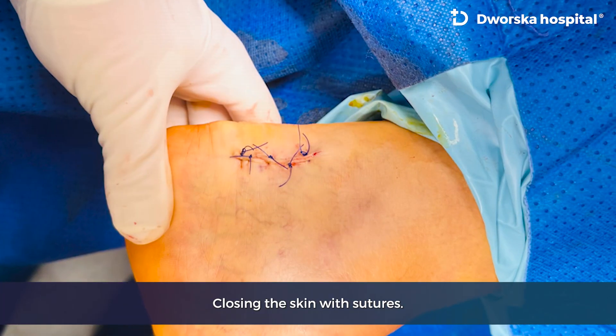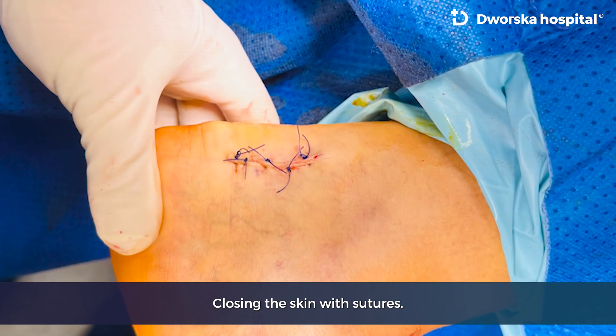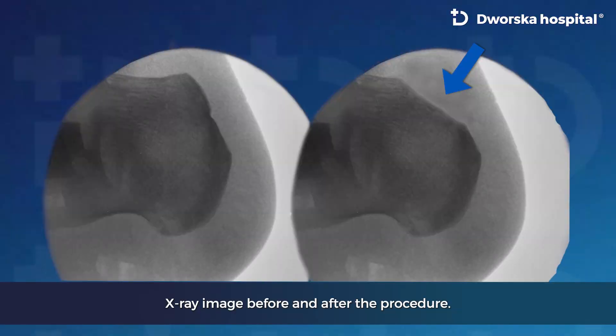Closing the skin with sutures. X-ray image before and after the procedure.